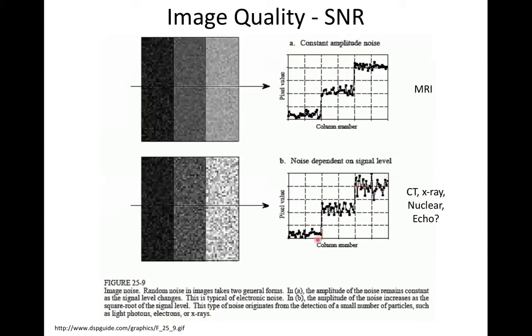And this is the case in X-ray imaging, because the high signal in CT is the regions in which there is a lot of photon attenuation. And so you don't have as many photons to count. You have less precision in counting those photons, and the amount of noise in that region of the image goes up. Right?